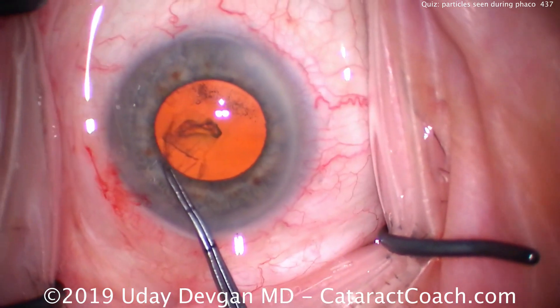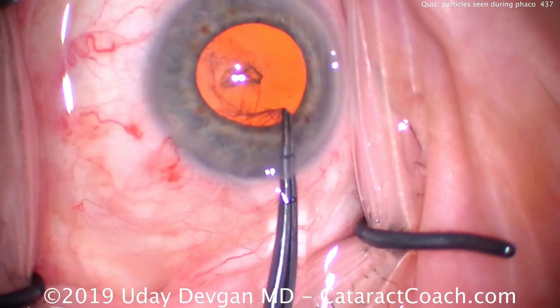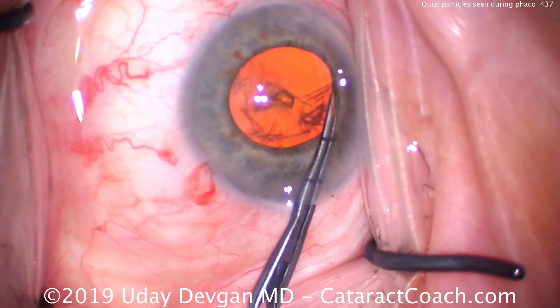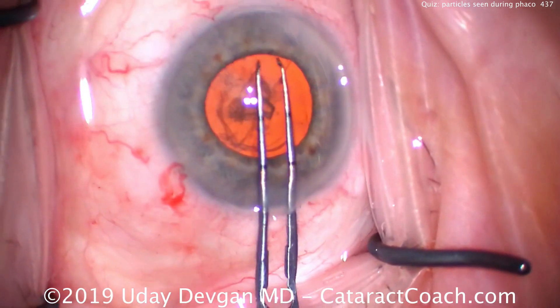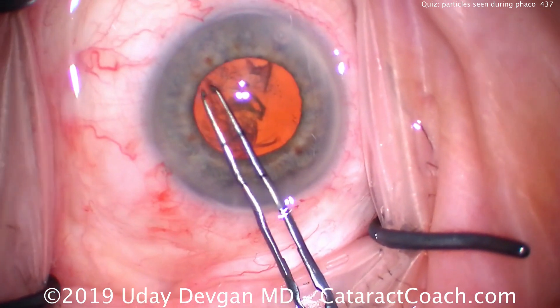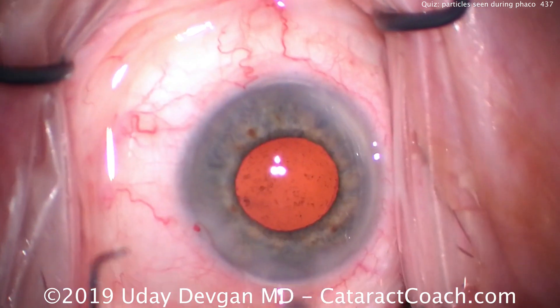As you can see, we start with a normal capsulorhexis. I know ahead of time this patient has had prior trauma and does have loose zonules. Taking that into account, we're still creating a nice, sufficiently large capsulorhexis. The patient has this level of dilation, so we're going to make our rhexis just about as big as the pupil — about five millimeters or so. Then we'll get the nucleus out. At the beginning, it looks pretty clear in the anterior vitreous. Nothing really going on there.